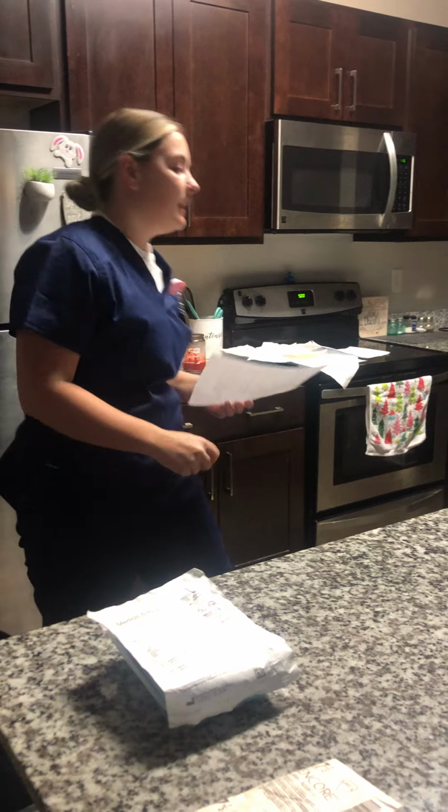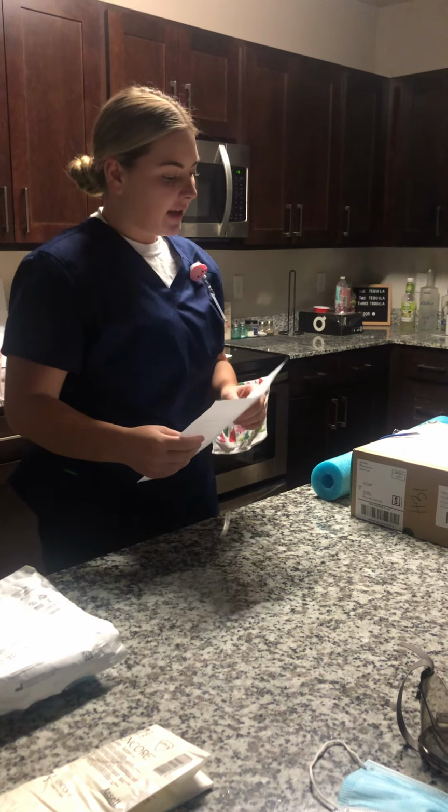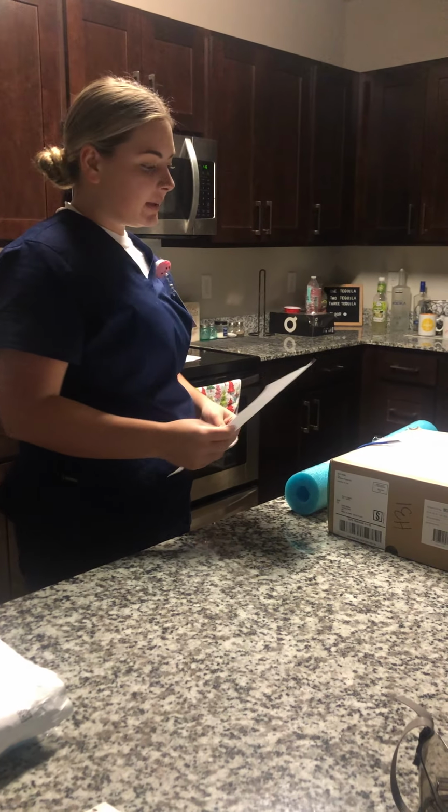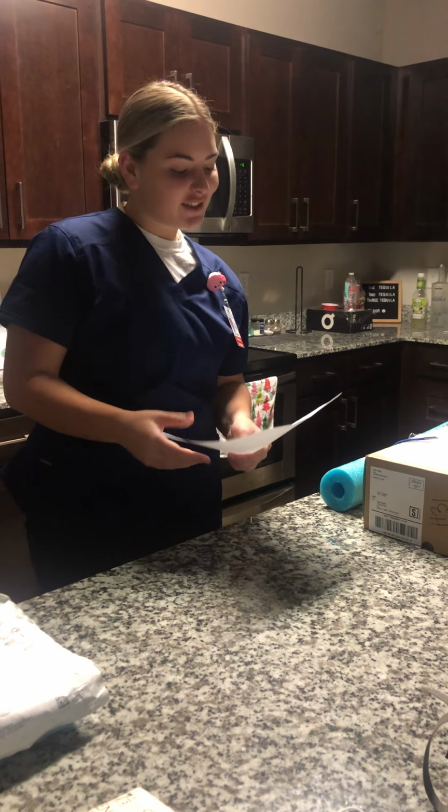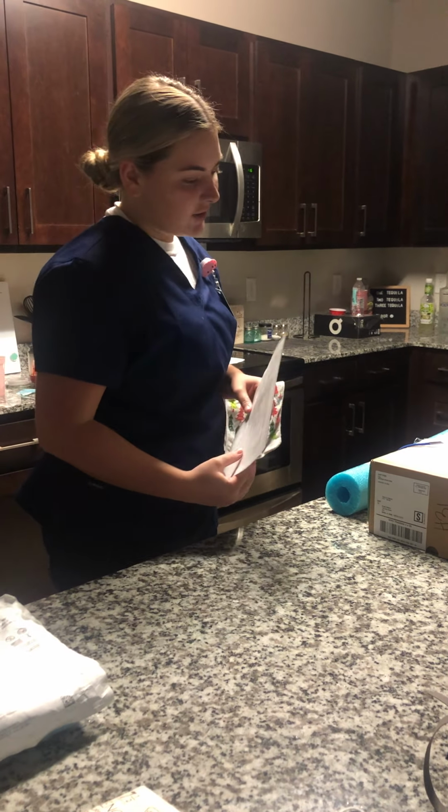Knock, knock. Hey, Mr. Jones, I'm going to be your student nurse today. My name is Kirsten Walters, and I'm going to be doing your central line dressing change. So if you have any questions or concerns, you can ask me. So he doesn't have any questions or concerns.